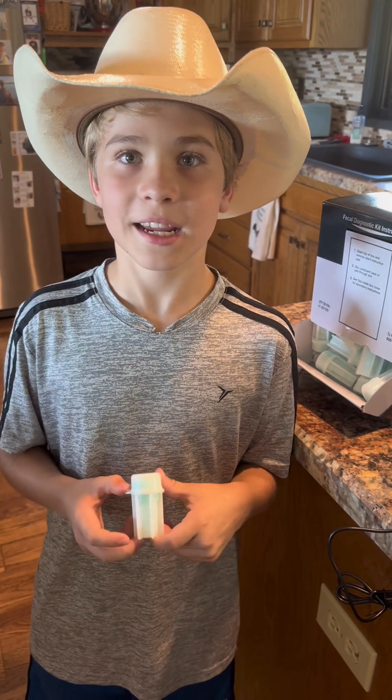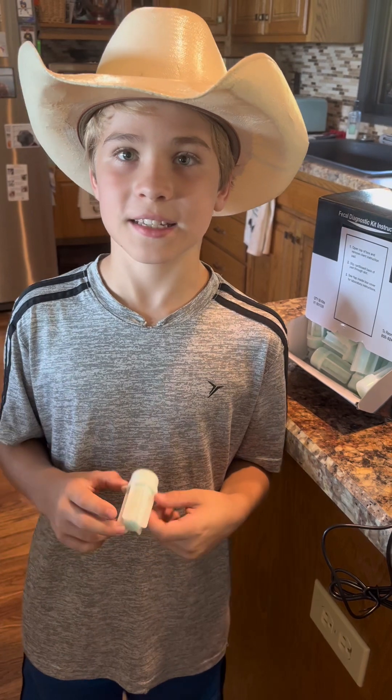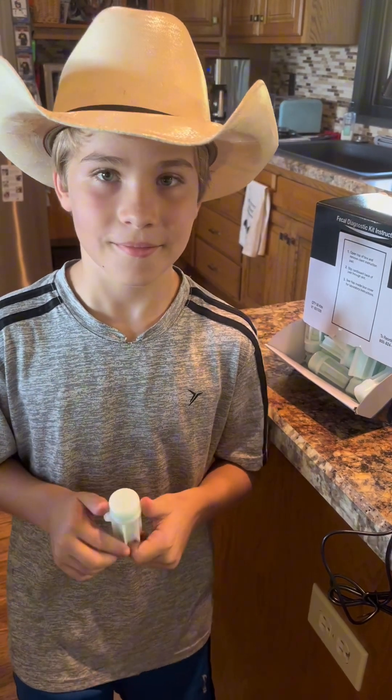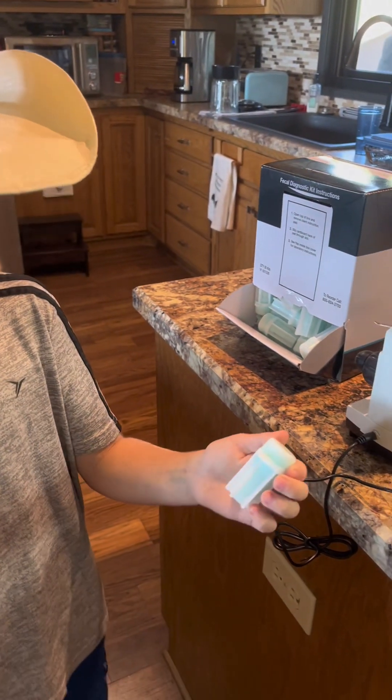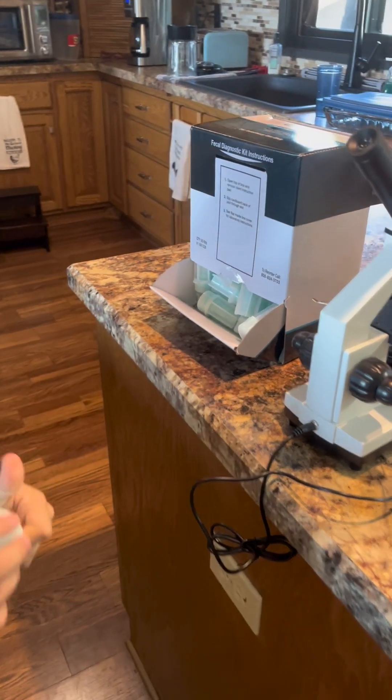We're going to show you how to diagnose intestinal parasites in your chicken's eggs. You can also look for intestinal parasite eggs in your dog's and cat's poop as well.